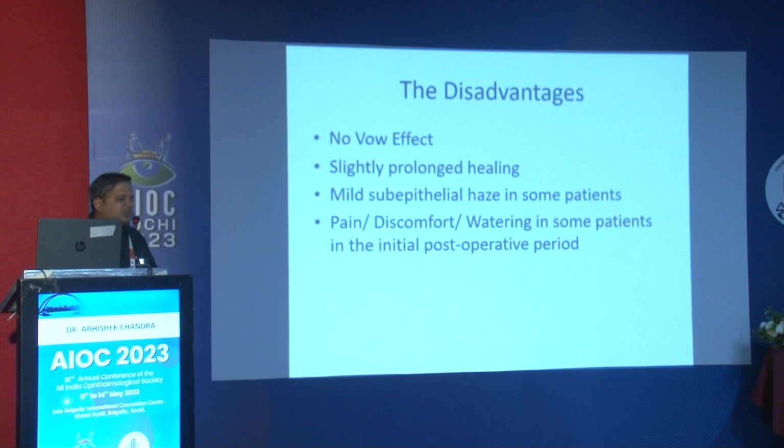And in very few patients, it's very difficult to predict, but there have been reports of mild subepithelial haze, which is there with any kind of PRK, but usually this is very less. And in the initial period, there can be pain, discomfort, and watering in some patients.